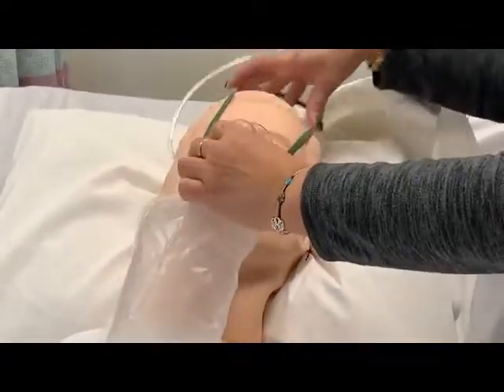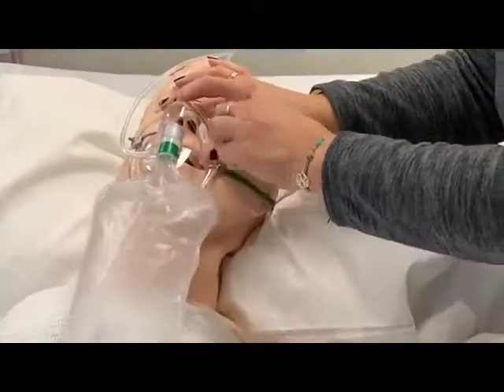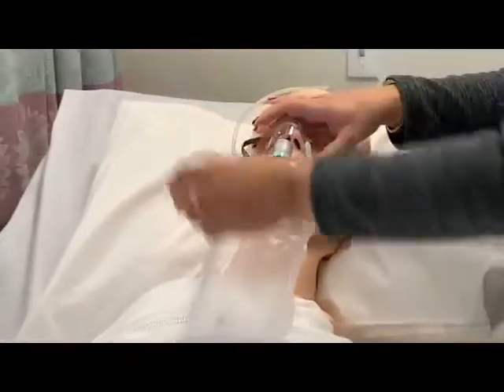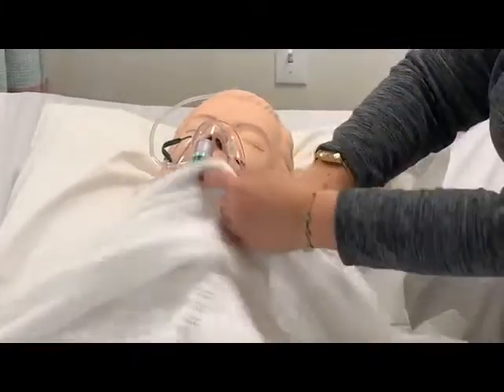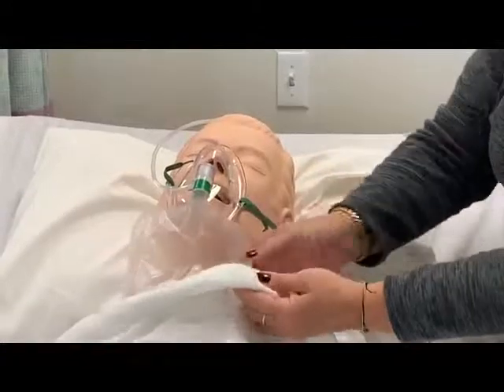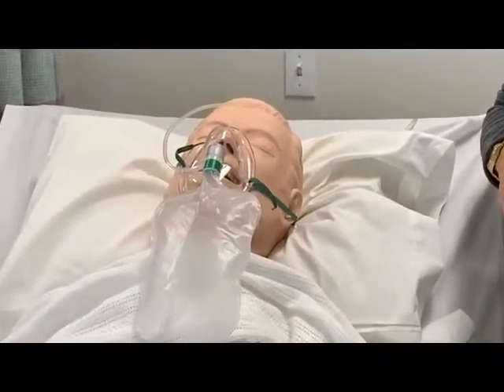It's going to go on just like the Simple Mask, very simple. Just put it over the top here. You can tighten it again with those straps. The other thing that you want to be conscious of is that you don't want this bag covered with blankets or something that could deflate that bag a little bit. Always make sure that it's on the outside and that your patient understands the importance of that.